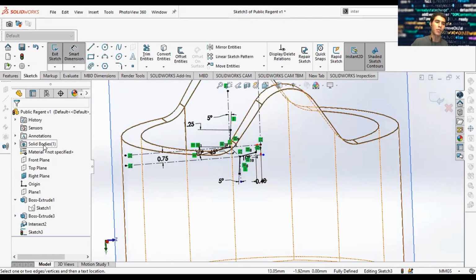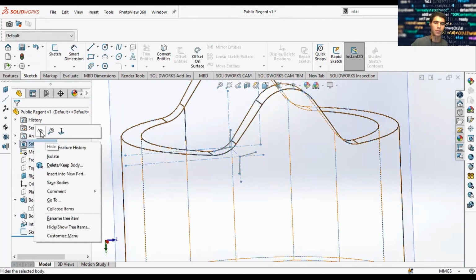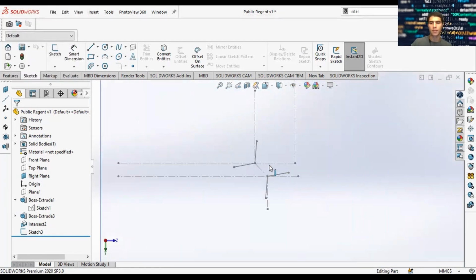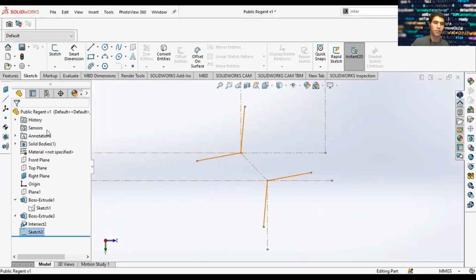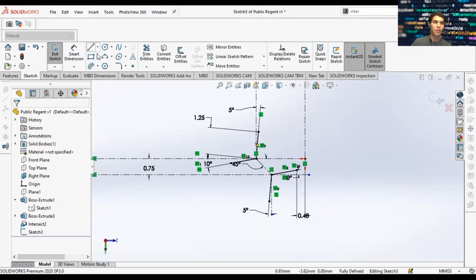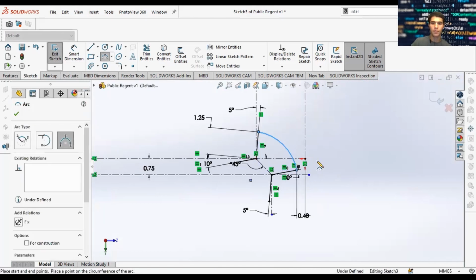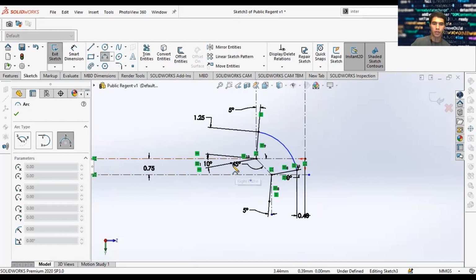So now I can have an idea of what it looks like. We'll go ahead and hide this body. Approve this, hide the body. It's just right now a couple of lines, but we're going to add an arc to it. And sketch. Let's add a 3-point arc to it. Another 3-point arc on this side.